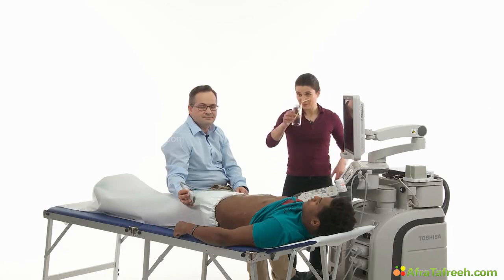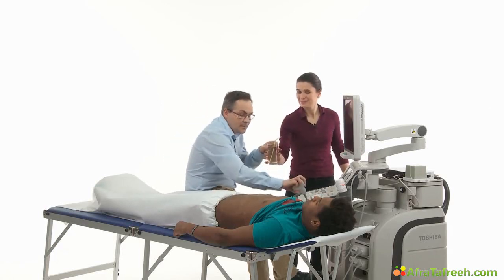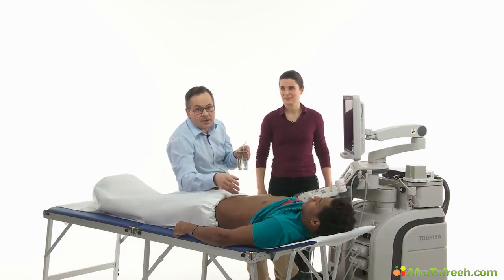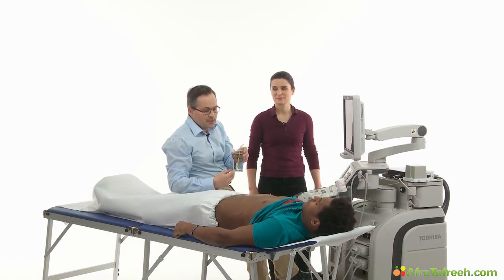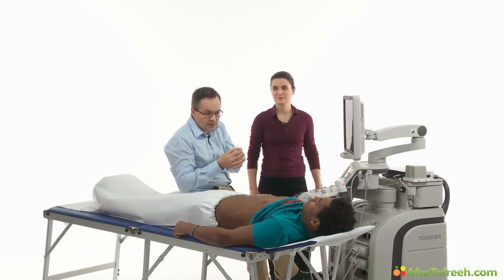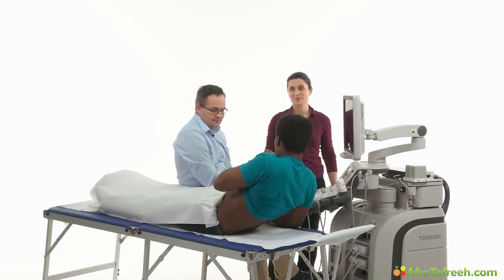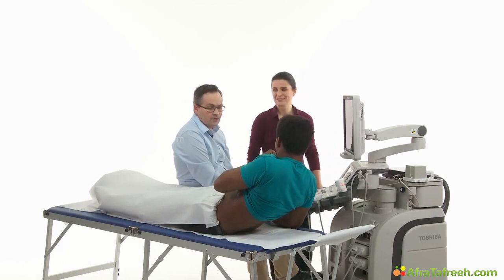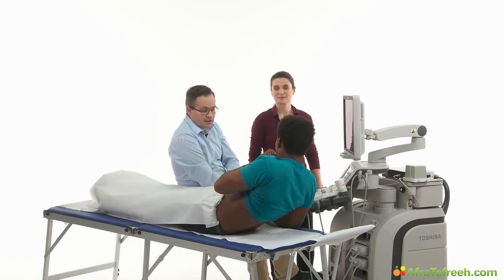A glass of water. How can a glass of water help us in this case? The main problem now is gas in the stomach. So we want to replace it with water by drinking a glass of water. The best way to do it is to use a drinking straw. So please, take a glass of water. And don't use carbonated water, obviously. And don't use the water directly from the water pipe, because there would be gas bubbles injected into the liquid.